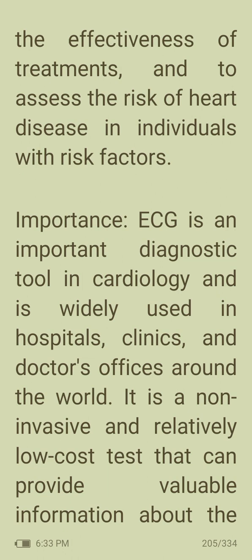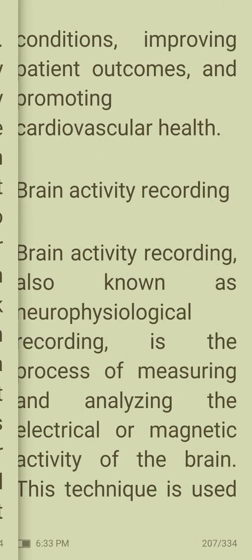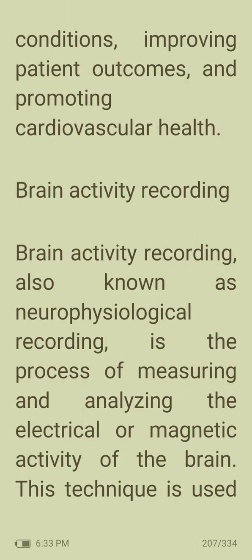ECG is an important diagnostic tool in cardiology and is widely used in hospitals, clinics, and doctors' offices around the world. It is a non invasive and relatively low cost test that can provide valuable information about the function of the heart. ECG can help identify heart problems early on before they become more serious and can help guide treatment decisions. It is also useful in screening for heart disease in individuals with risk factors such as high blood pressure or a family history of heart disease. Overall, ECG is an essential tool for diagnosing and managing heart conditions, improving patient outcomes, and promoting cardiovascular health.